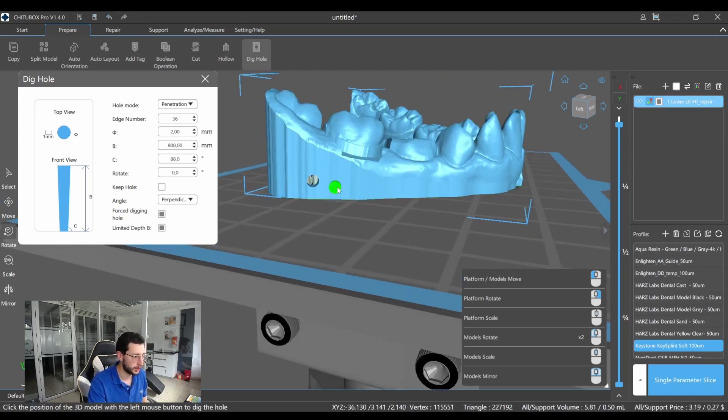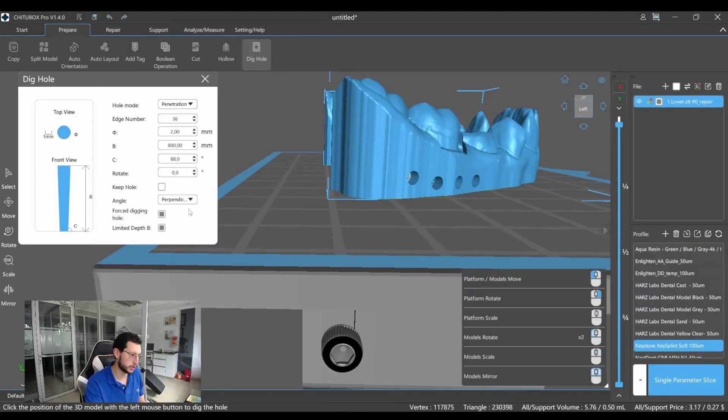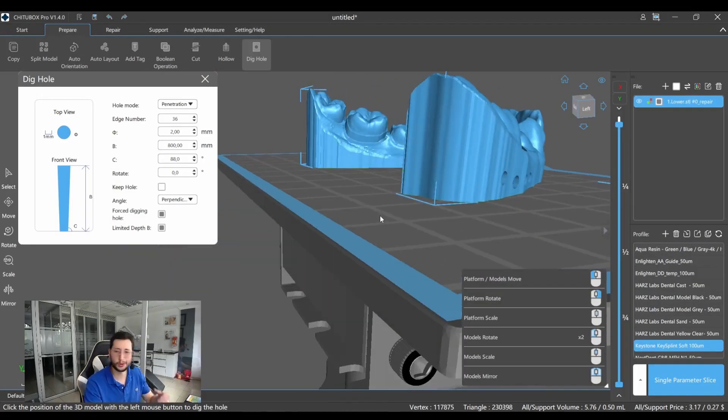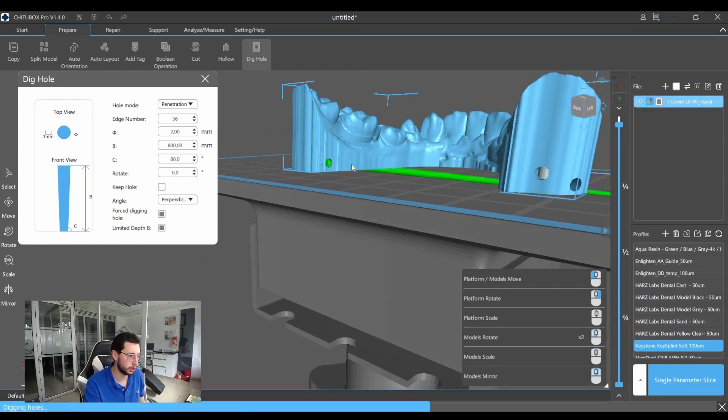Now I can add some holes around the model — and the same on the other side. There are many parameters here to decide about. If you want me to explain further, I'll cover that in a separate video, but for now just having some holes around the model will be fine.